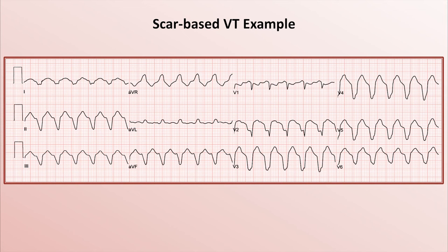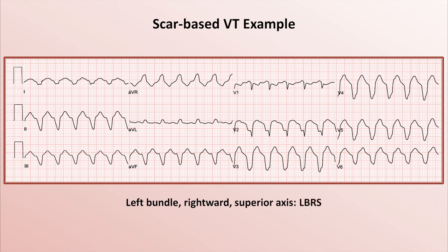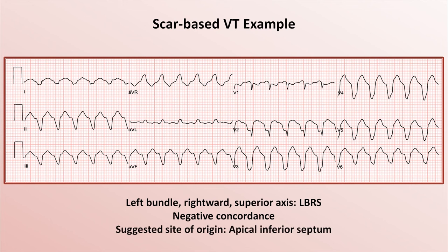The second example is a little trickier. There is a left bundle pattern in lead V1. Lead I is down-going, so a rightward-directed axis. The inferior leads have negative complexes, so a superior axis. This is LBRS VT, with negative concordance in the precordial leads. When thinking about the site of origin, the left bundle suggests the RV or potentially the septum. However, the rightward axis in lead I seems to suggest a lateral focus — which initially seems to contradict the left bundle — until you remember that a rightward axis can also be seen in apical VT of the septum or even the RV. The superior axis strongly suggests an inferior location. So the suggested site of origin is the apical inferior septum, though a VT originating from the RV apex could also potentially have a similar appearance.